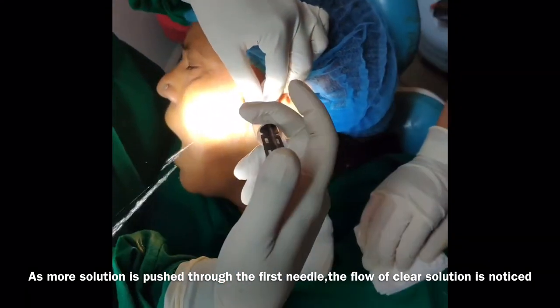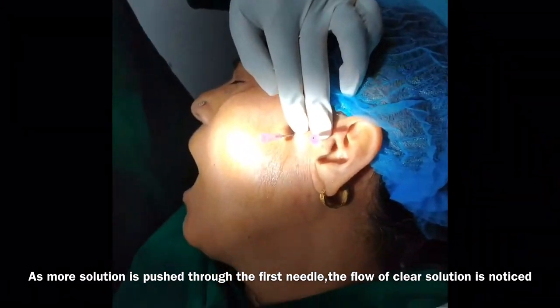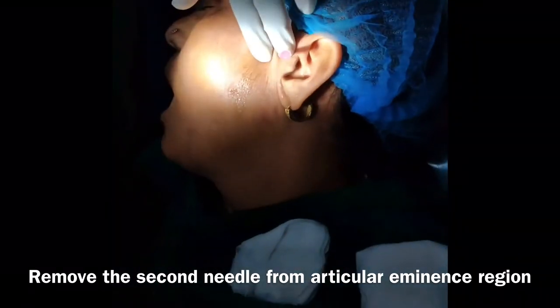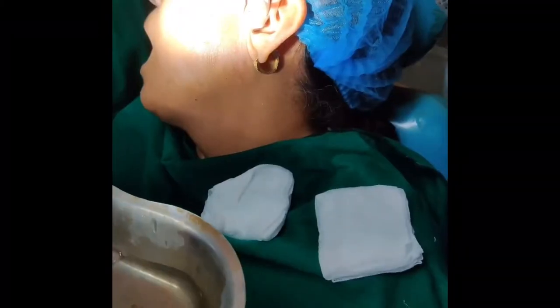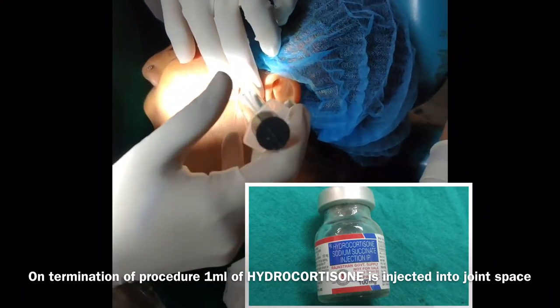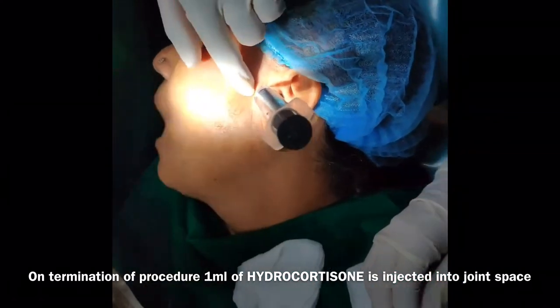As more solution is pushed through the first needle, the flow of clear solution is noticed — you can see this in the video. Now you can remove the second needle while stabilizing the first needle. On termination of the procedure, inject one ml of hydrocortisone into the joint space to reduce inflammation.